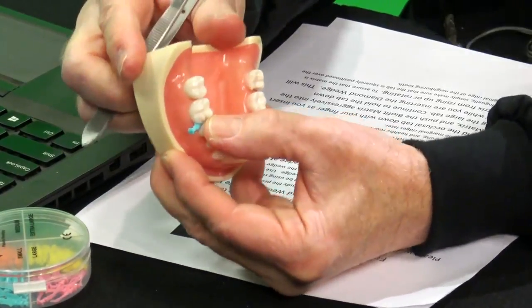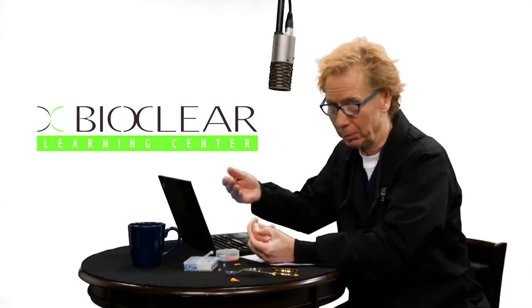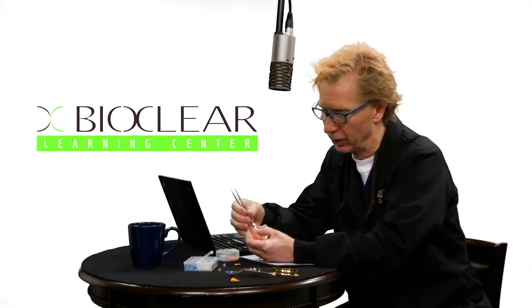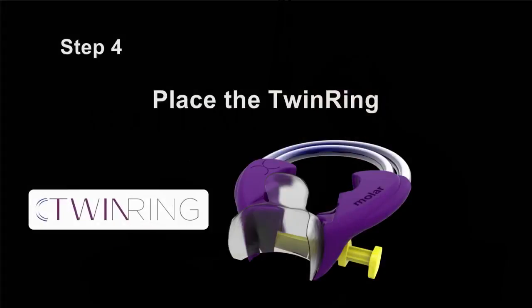Always hold the tab down, because if you don't, the matrix can slide lingually or buccally and can also rise up. We put this big fat tab on there so you can put your thumb or finger on it — that will really help the matrix stay right where you want it.